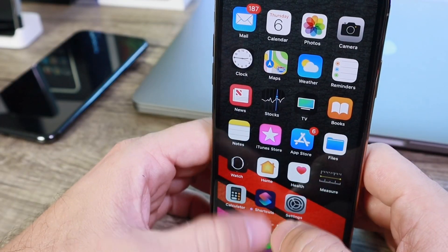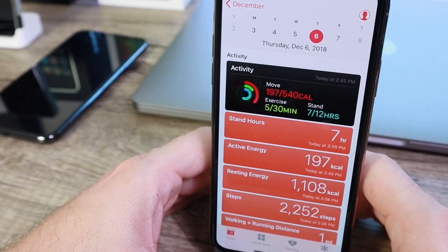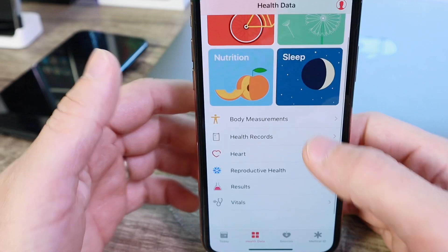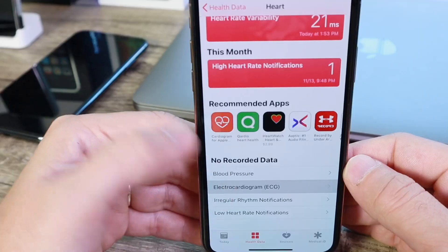Let's go to the Health application. When you first launch it you'll get prompted with a splash screen that'll ask you if you want to set it up. I'm going to go ahead and do it manually — you can go to Heart and then scroll all the way down and you'll see the Electrocardiogram option. We can go ahead and set it up.